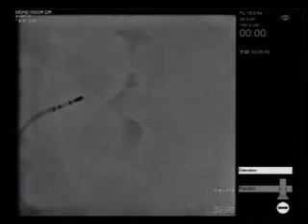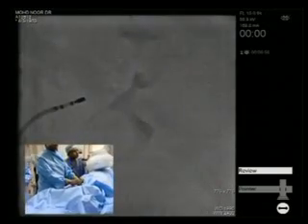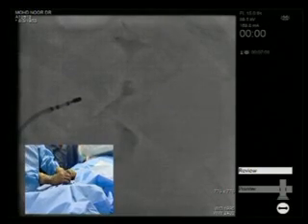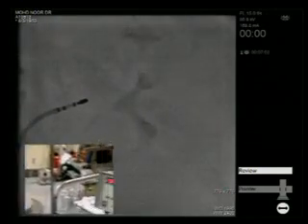So this is the second spot, which is going to be on the posterior wall of the renal artery at a different point. We're going to start the second section here. Impedance is 218. Can you go to the impedance, please? Start the RF, please.